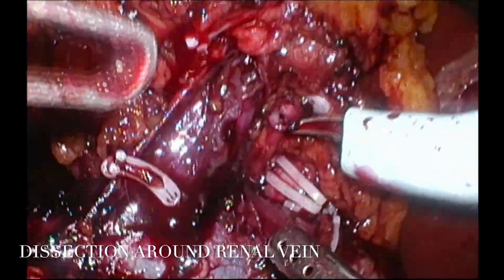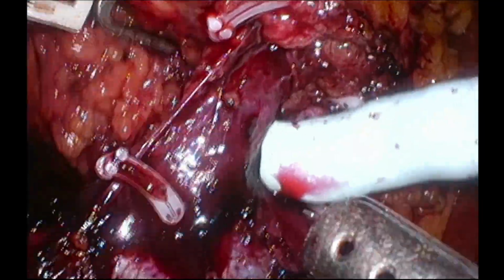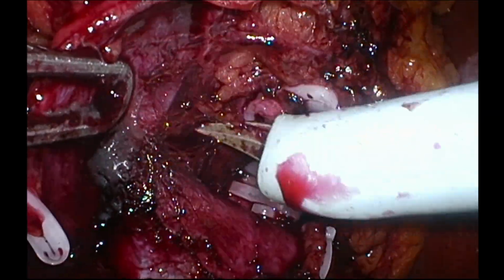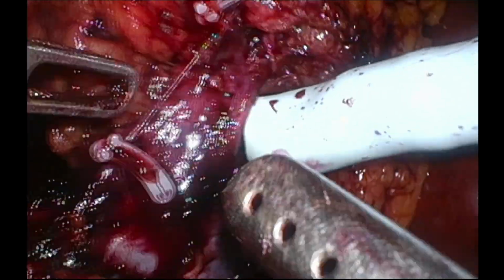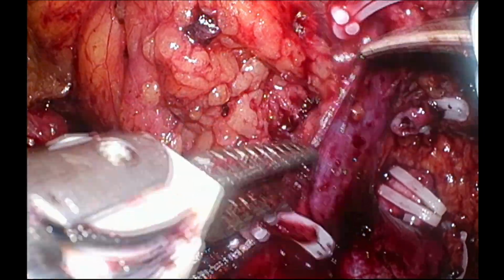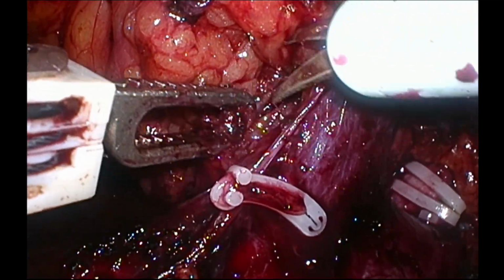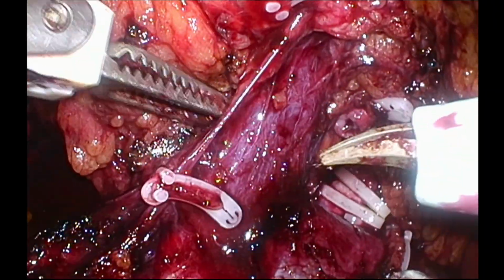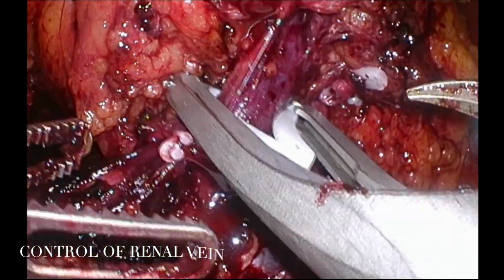Renal vein is adequately dissected from the surrounding tissue and a window is created behind the renal vein. After making proper window around the renal vein, hemolock clips are applied.